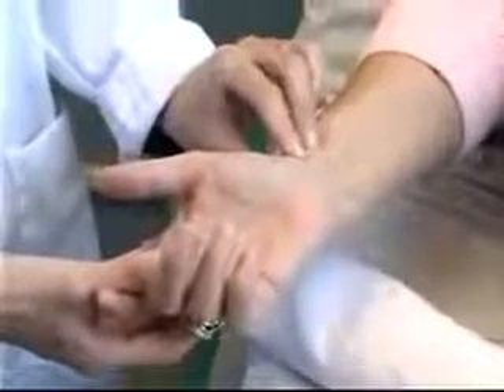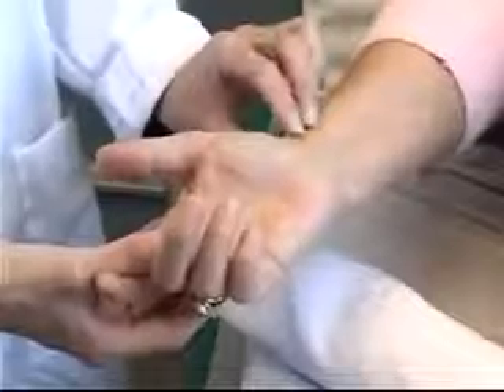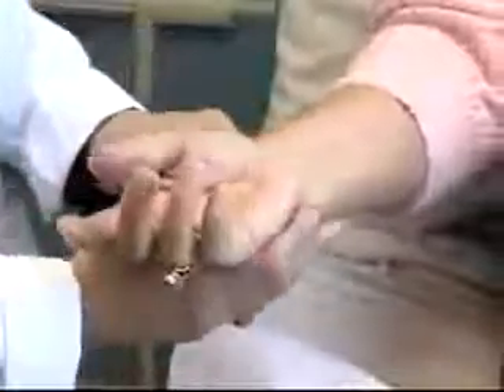We'll begin the procedure with performing the Allen's test. The most common site chosen for blood gas sampling is the radial artery of the non-dominant hand. Once you've chosen the hand, before you can proceed with the procedure, you must first perform an Allen's test, which indicates whether or not there's collateral circulation to the limb.